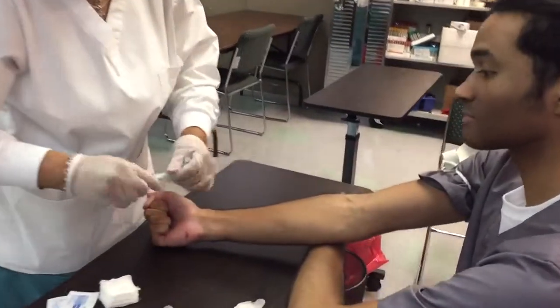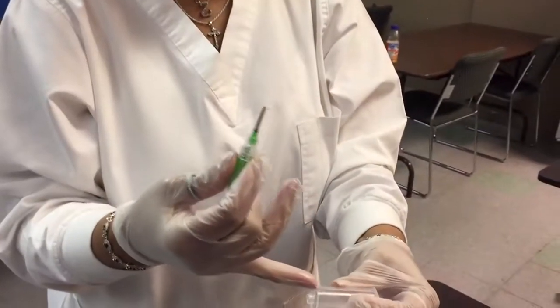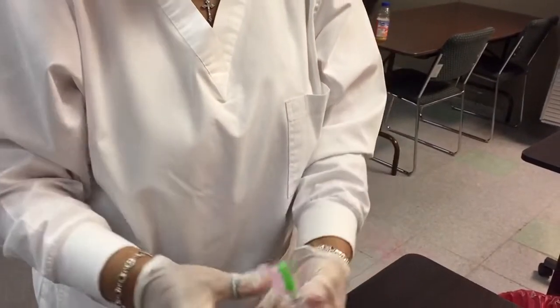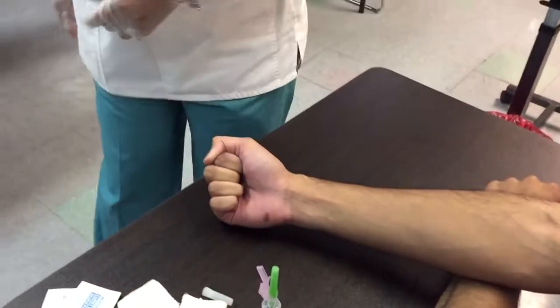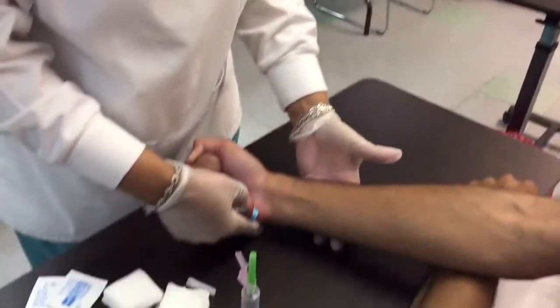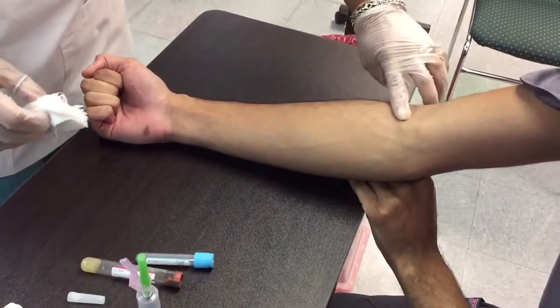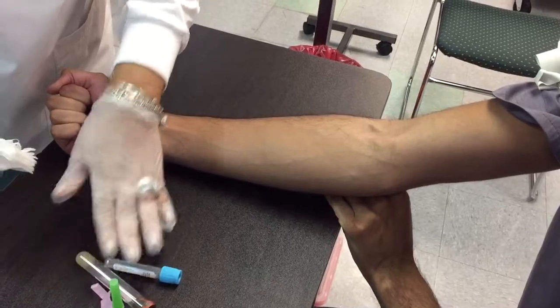Start setting up your equipment. You have your adapter connected to your 21 gauge needle — this is your vacutainer, also known as the hub. Get your alcohol ready. Have your tubes assembled, always on your dominant side. Do not lean over to reach for them. Set your tubes up in the order of draw — you have no more than a minute.